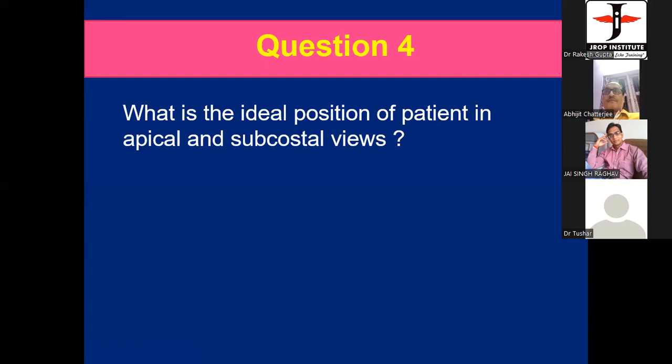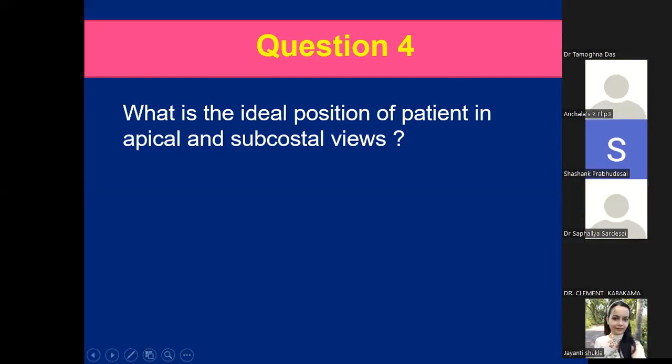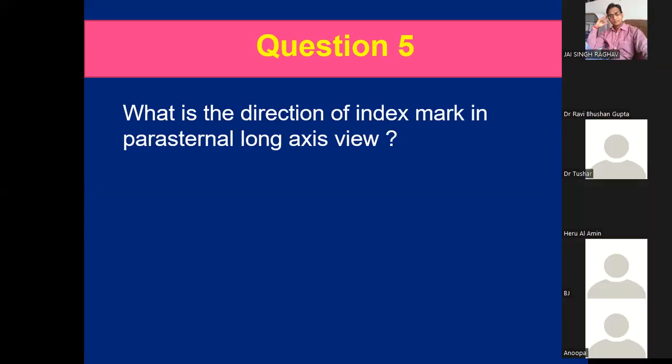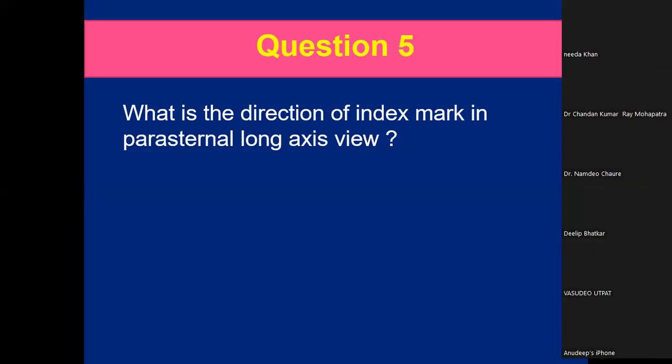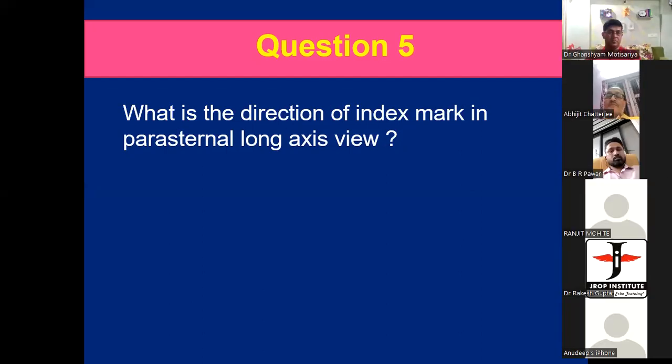Subcostal window, what is the position of the patient? The patient should be supine or lateral? Supine. Supine. Okay. Why are you taking so much time? This is a very simple question.